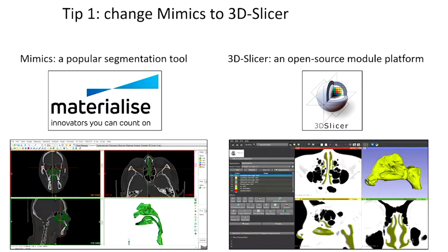3D Slicer is an open source modular platform.